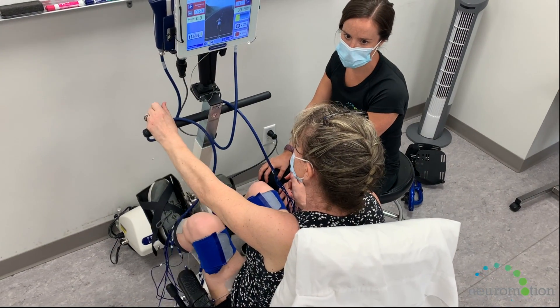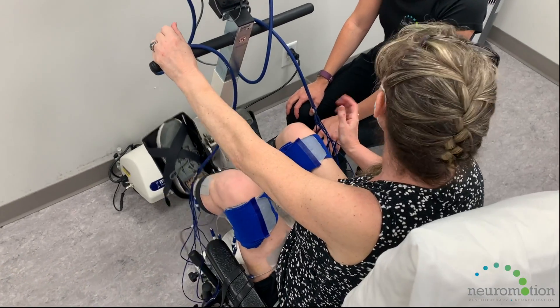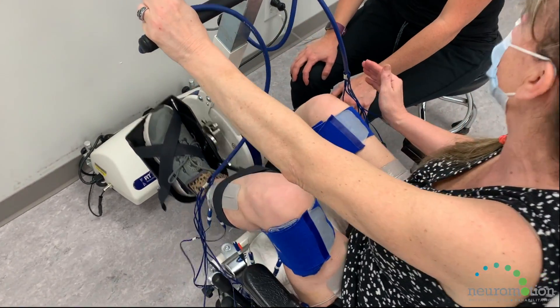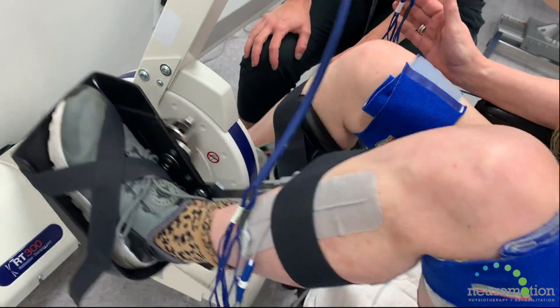FES cycling uses coordinated electrical stimulation to create a cycling pattern, exercising the large muscles of the legs. The electrical current passes through intact peripheral nerves to the muscle, causing a contraction.